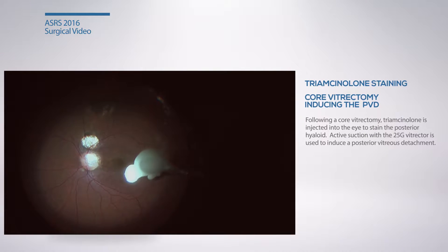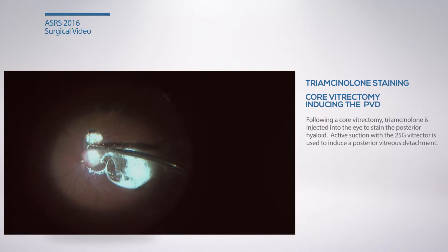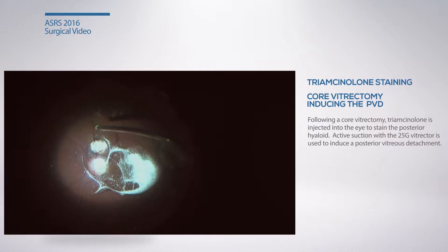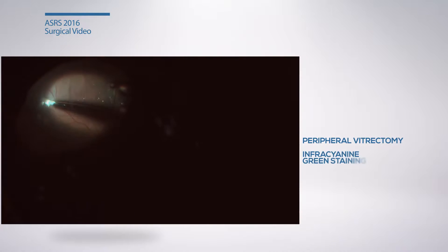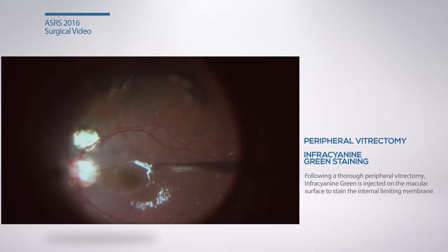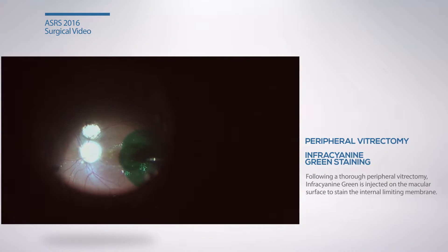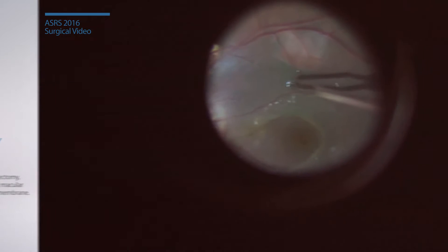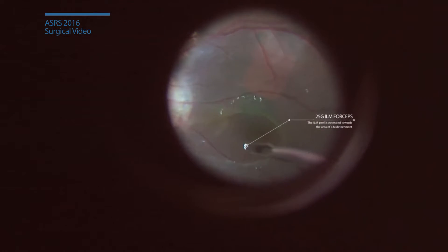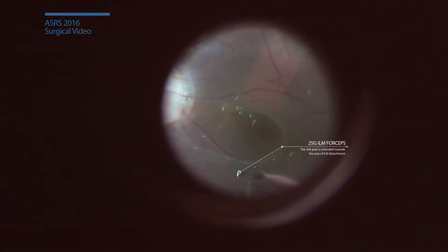A 3-port pars plana vitrectomy is begun in the usual fashion. Following core vitrectomy, triamcinolone staining is used to induce the PVD in this young patient. The peripheral vitrectomy is completed and ICG staining of the macula is performed.